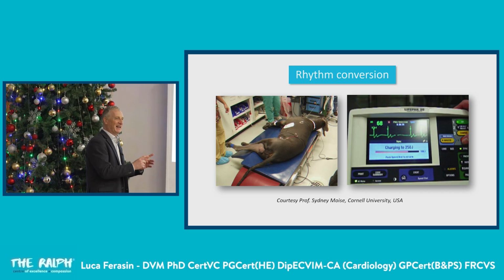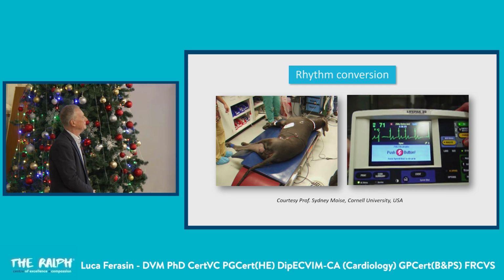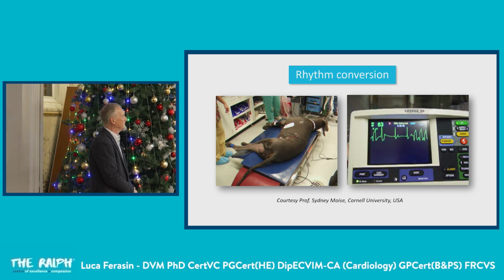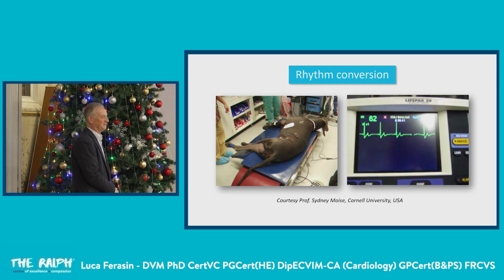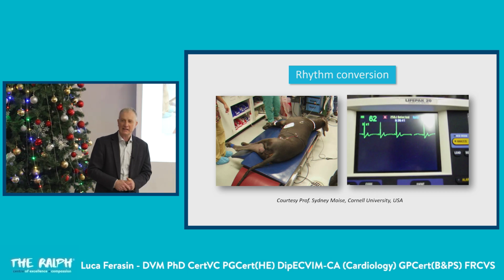But I've also got the conversion to show you on the screen, which is lovely because if you have met Sidney Moise before, you know how enthusiastic this cardiologist is. You tell me where to now. Nice. Oh, we have time to spare. Yes, we do. A lot of excitement. Probably this dog was back in atrial fibrillation an hour later, but there we go. That's cardioversion for you.